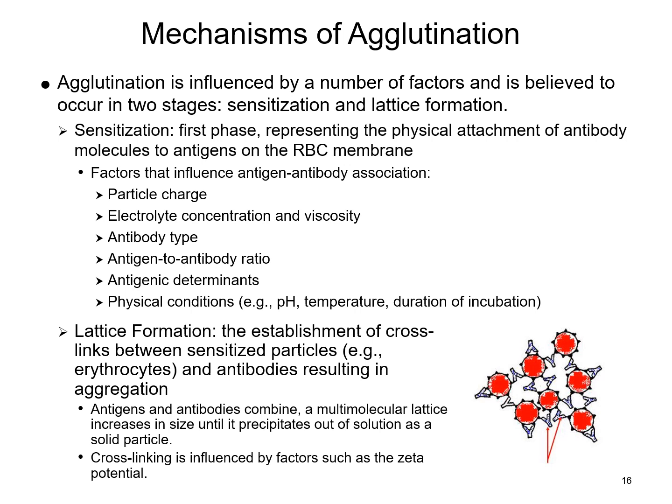What that does is release the antibody into whatever it's in. Releasing that antibody is what we refer to as an elution. There are different procedures out there, and the most common place you'll see this referred to is within blood bank. But basically, an elution is taking and trying to extract an antibody from something.